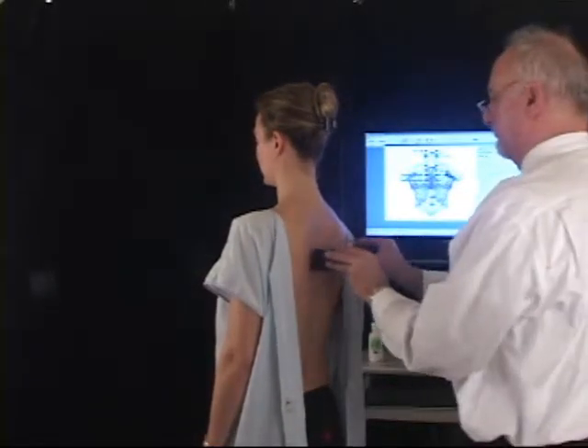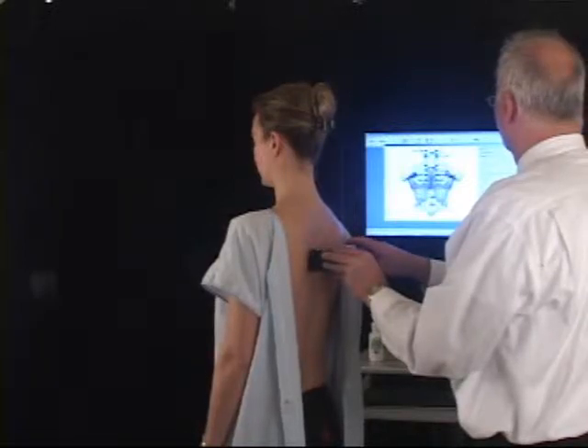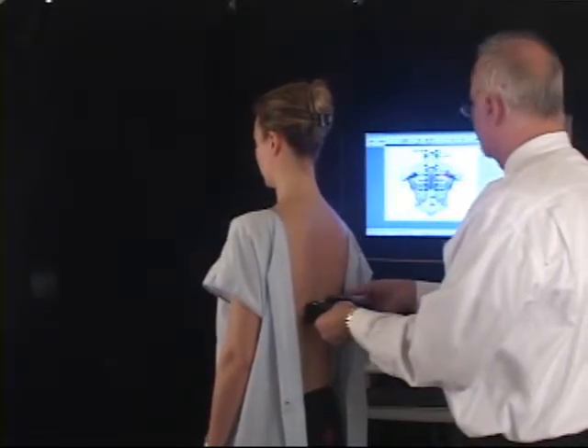As you work your way down the spine, make sure to hold the probes against the skin and press and release left or right button — but not both. Do not remove the probes until the software has told you to move to the next level.